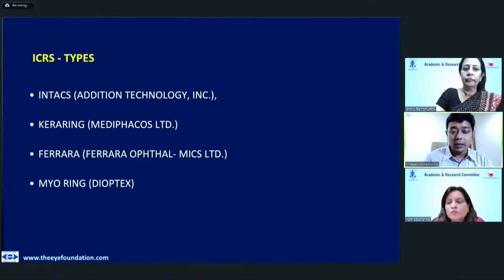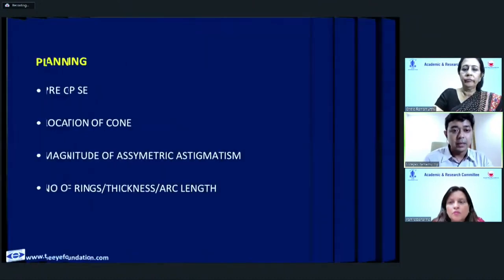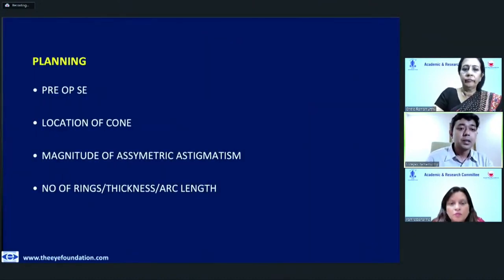I will be primarily talking about INTACS, although Keraring, Ferrara ring, and a host of other rings out of Brazil and Argentina are available. But I'll primarily talk about the INTACS planning.